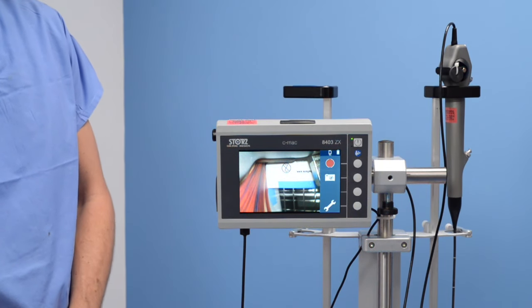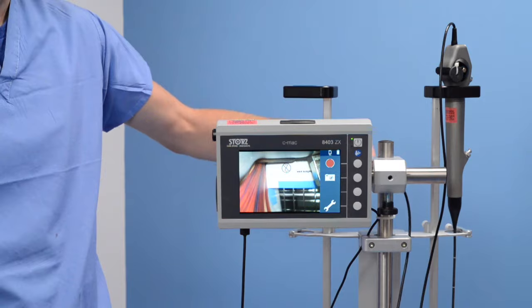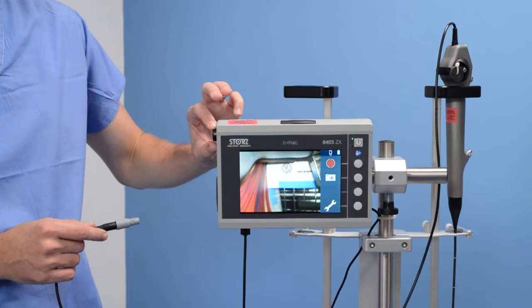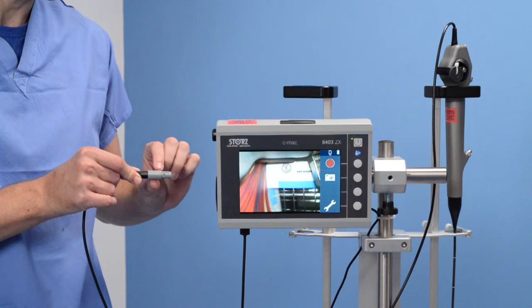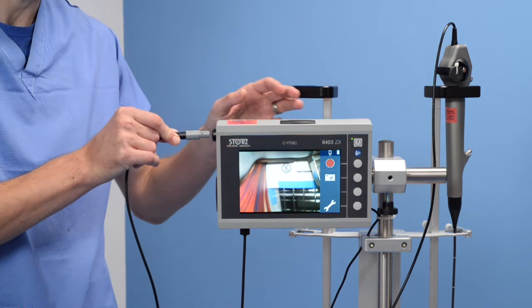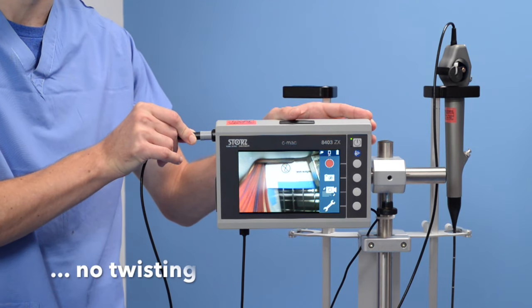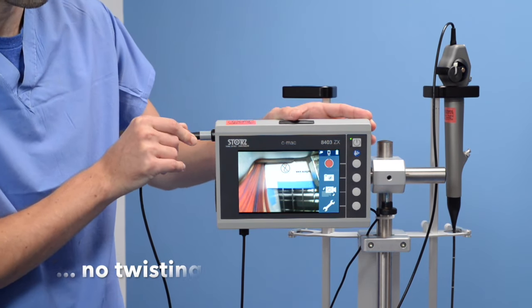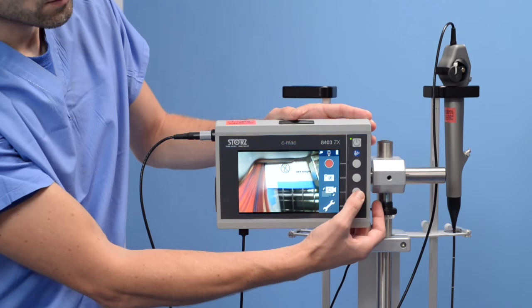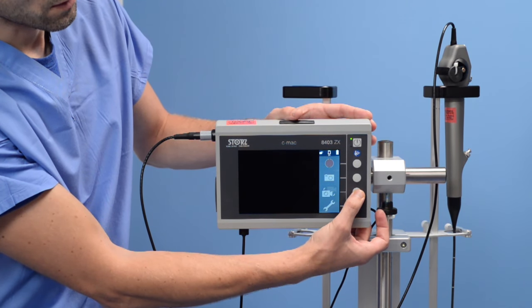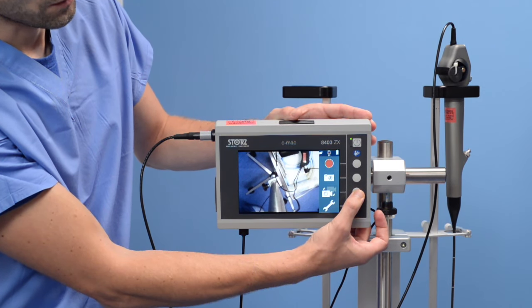To connect the fiber optic scope, take the connector to the side port. Marry up the arrows and very gently push forward. You'll hear a small click when it's engaged. There's no twisting involved. That allows you to change between the video laryngoscope and the fiber optic.